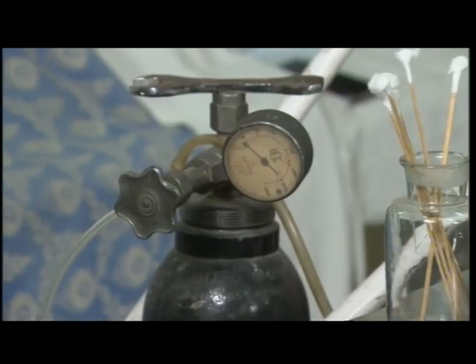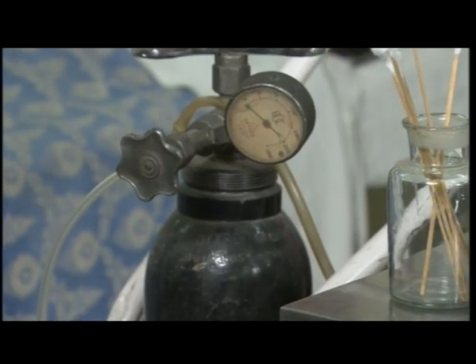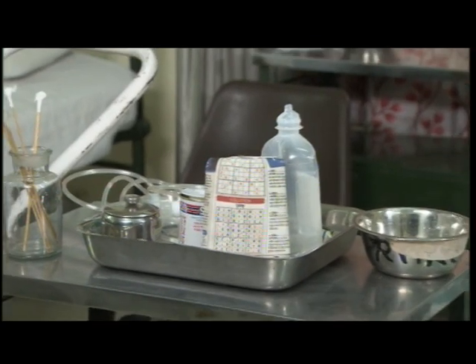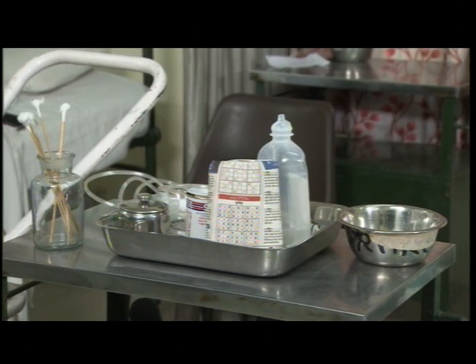Hello friends, today I am going to show you the procedure of oxygen administration through oxygen mask, specially the assisting part. I will be demonstrating the oxygen cylinder and the articles needed for the oxygen administration.